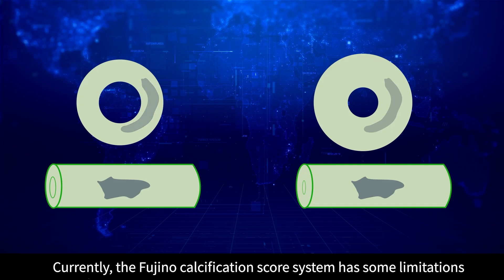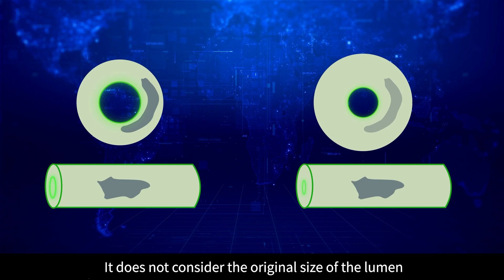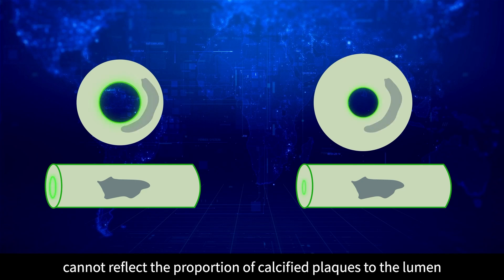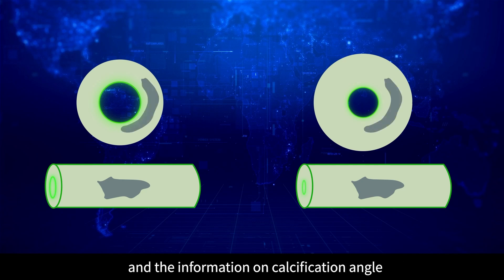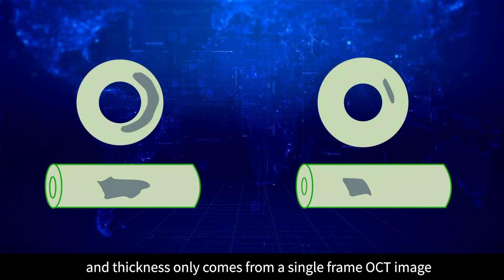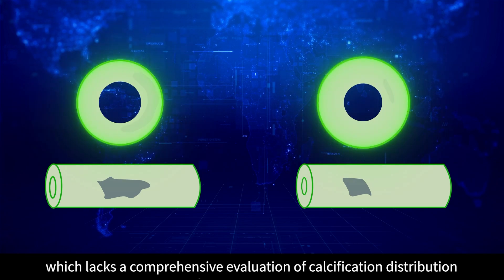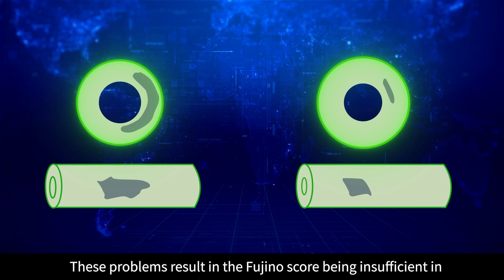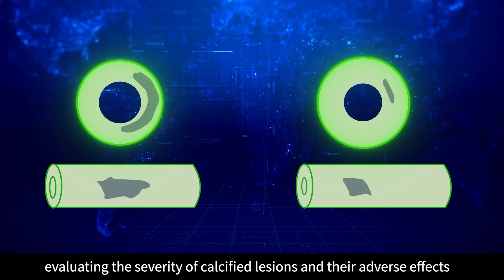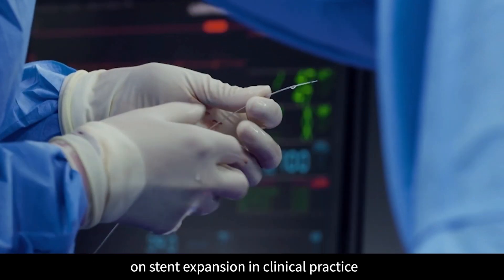Currently, the Fujino calcification score system has some limitations. It does not consider the original size of the lumen and cannot reflect the proportion of calcified plaques to the lumen. Furthermore, information on calcification angle and thickness comes only from a single-frame OCT image, which lacks a comprehensive evaluation of calcification distribution. These problems result in the Fujino score being insufficient in evaluating the severity of calcified lesions and their adverse effects on stent expansion in clinical practice.